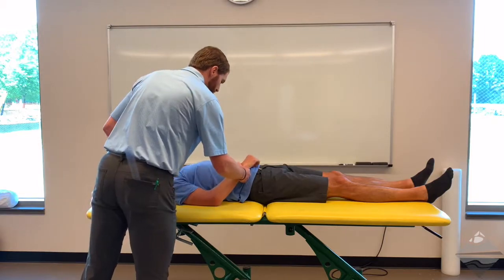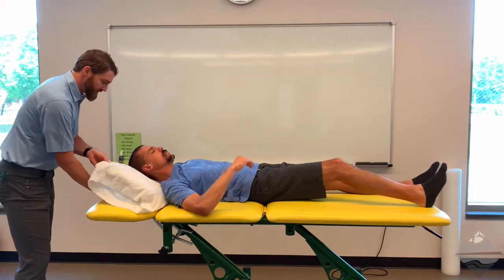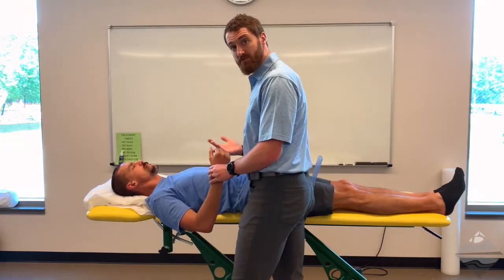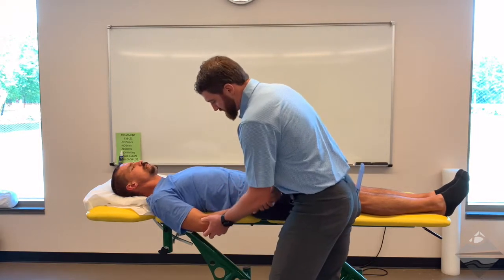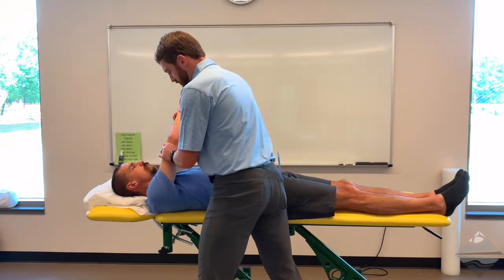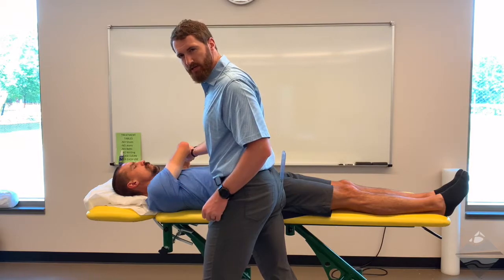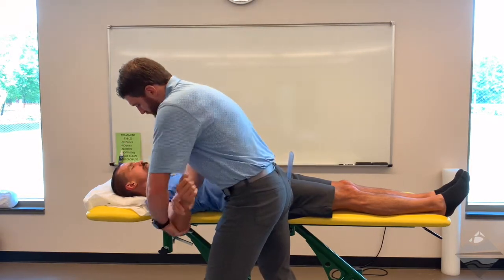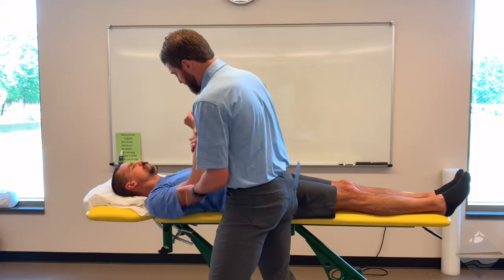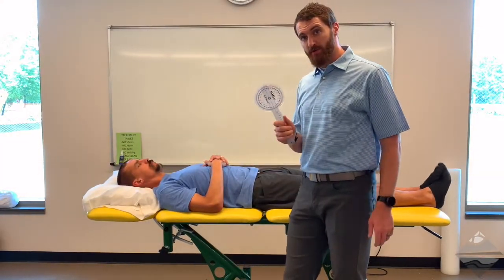Additionally, we can look at a couple of other planes of motion for the shoulder. For this, we need to have our patient slide all the way back to the opposite side of the table so their trunk is at the edge. Make sure you're coming in to block them for safety. From here we can look at things like shoulder extension, horizontal adduction to assess the posterior shoulder — also known as Tyler's test, which we'll discuss later — and horizontal abduction to look at the anterior shoulder. All of those can be assessed with goniometric range of motion, passively, with or without overpressure or end feel.